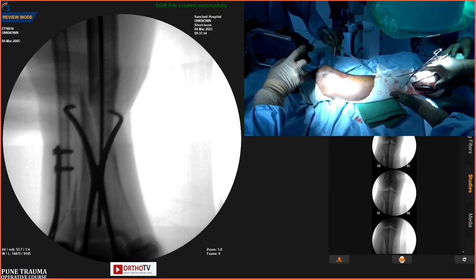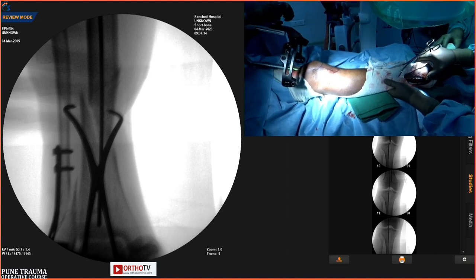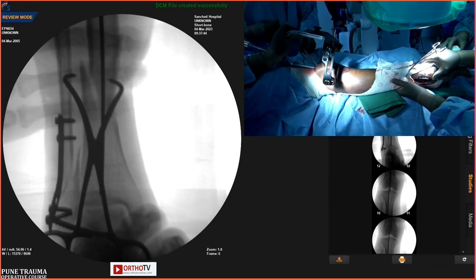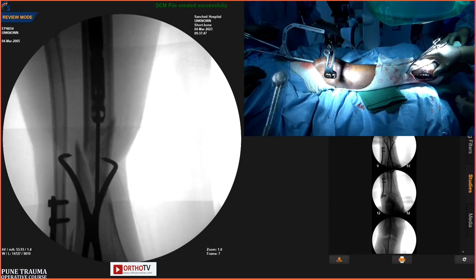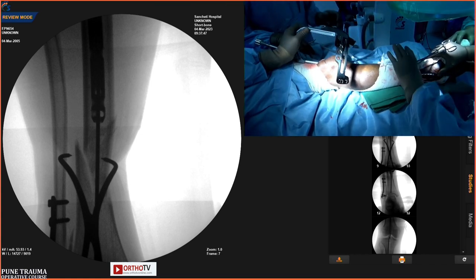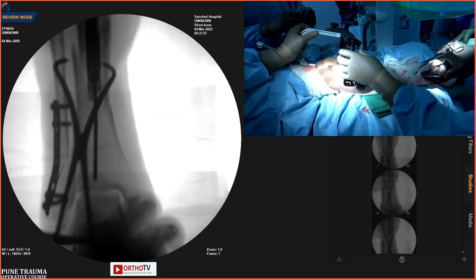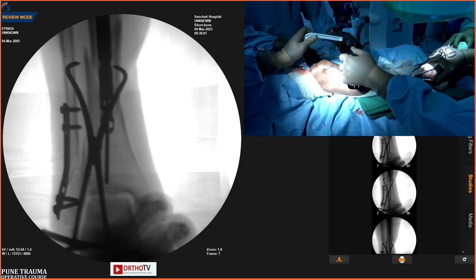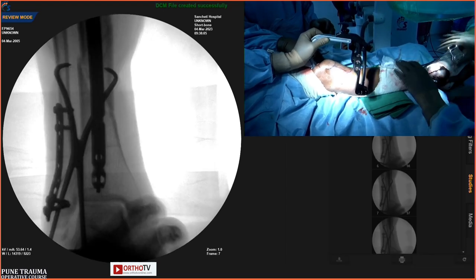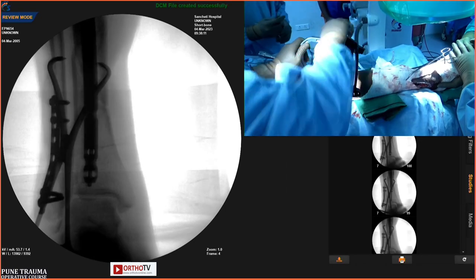Before you came, he had used a guide wire which had a bend away from the tip of the guide wire. That is a bent guide wire. So if you want to ream, you will have to ream over the unbent guide wire, which you can ream down and make it subchondral, which is going to be very useful for the lower one third tibia, particularly this comminuted fracture. Plus, sir, in the distal third femur also. When you want to seat the nail subchondral, you will have to pass the reamer and then hammer with the reamer sitting there, your guide wire down.